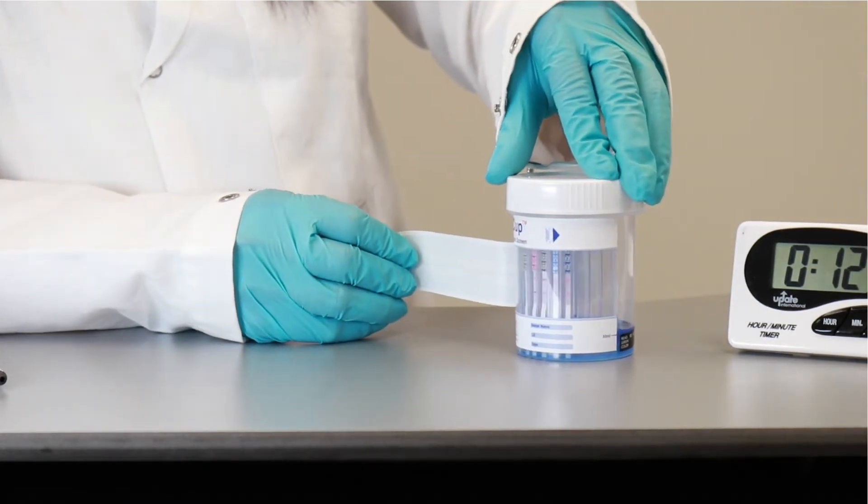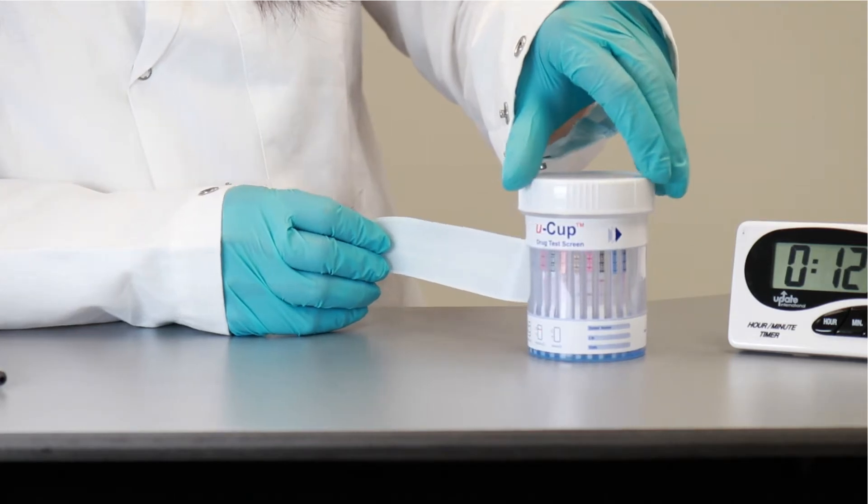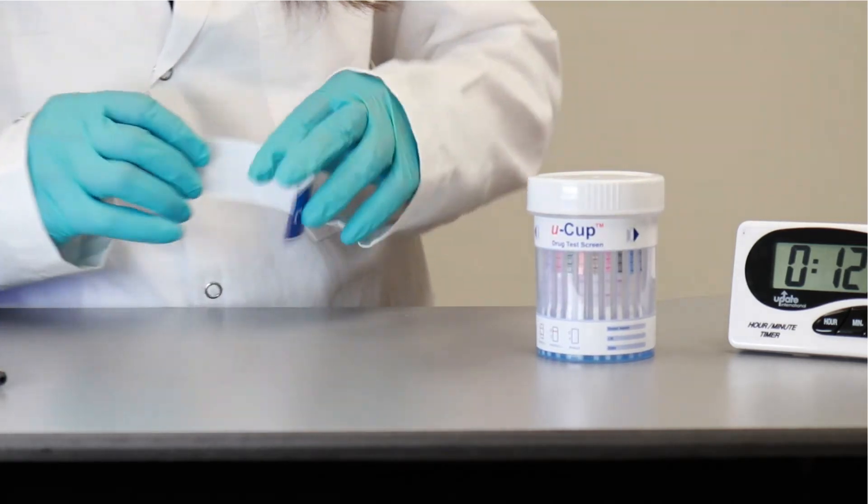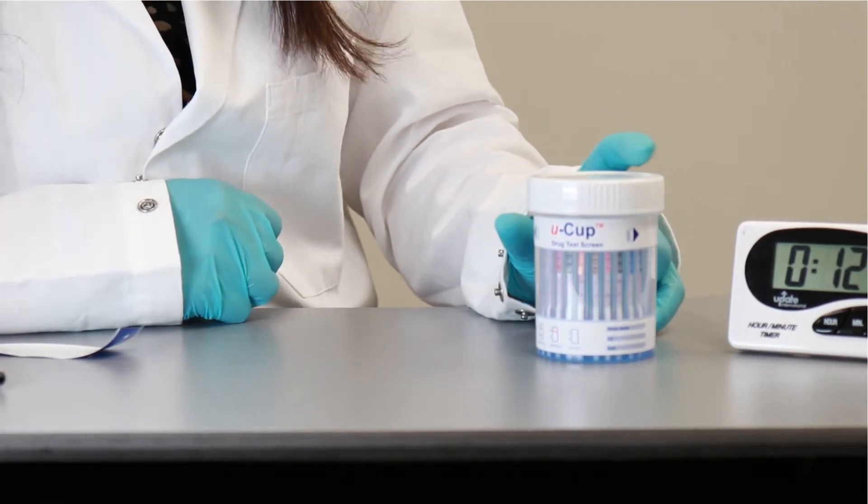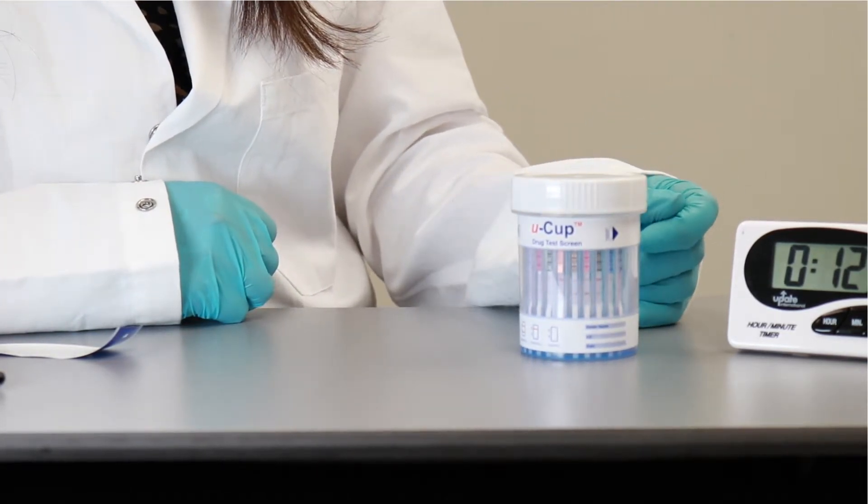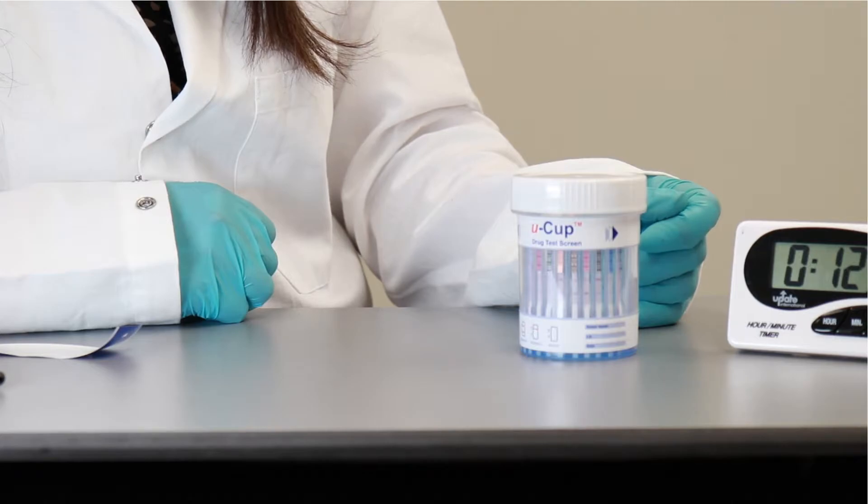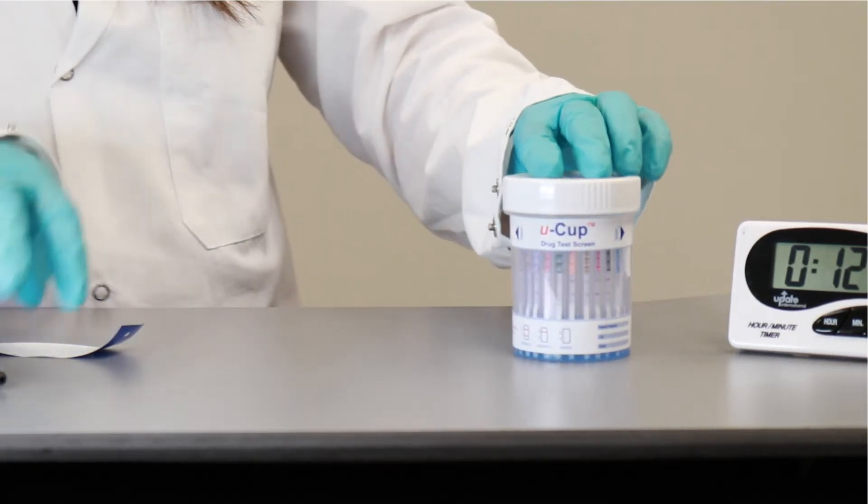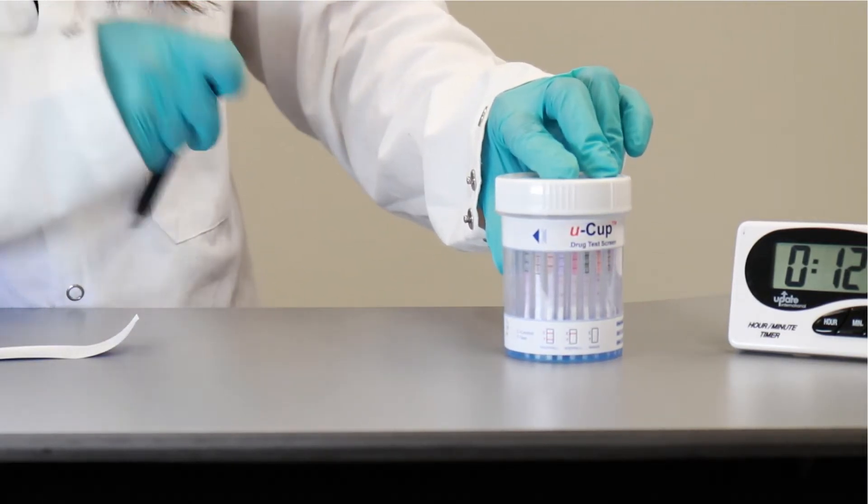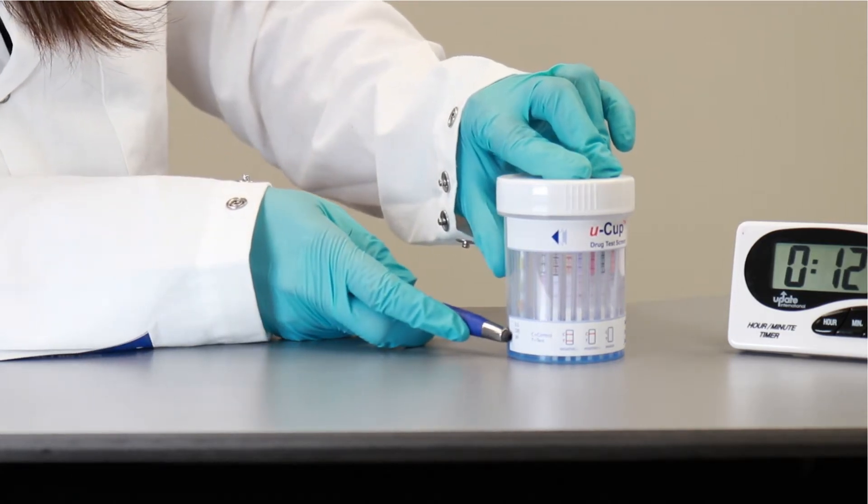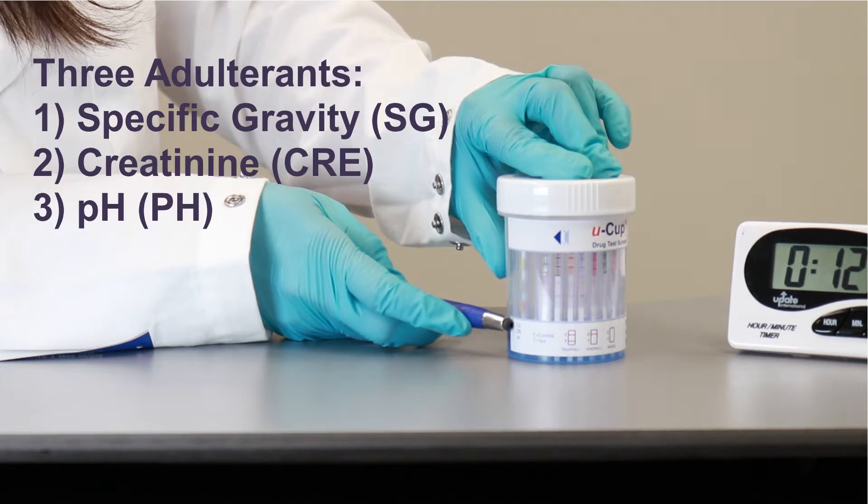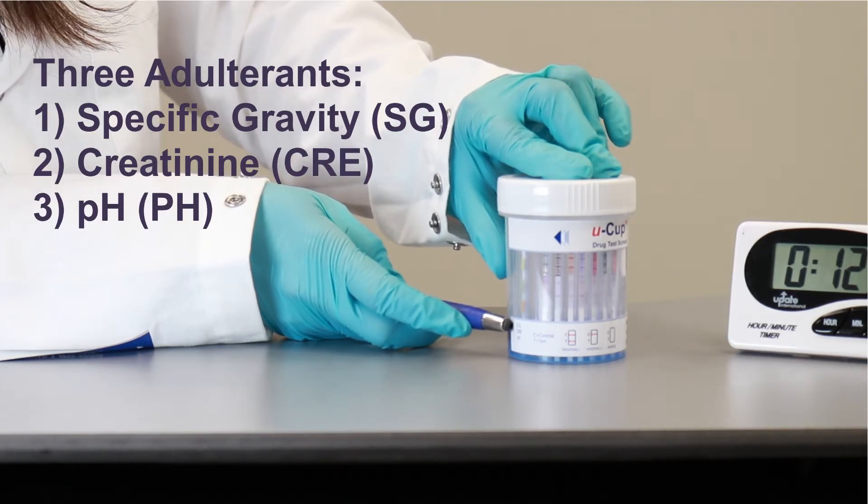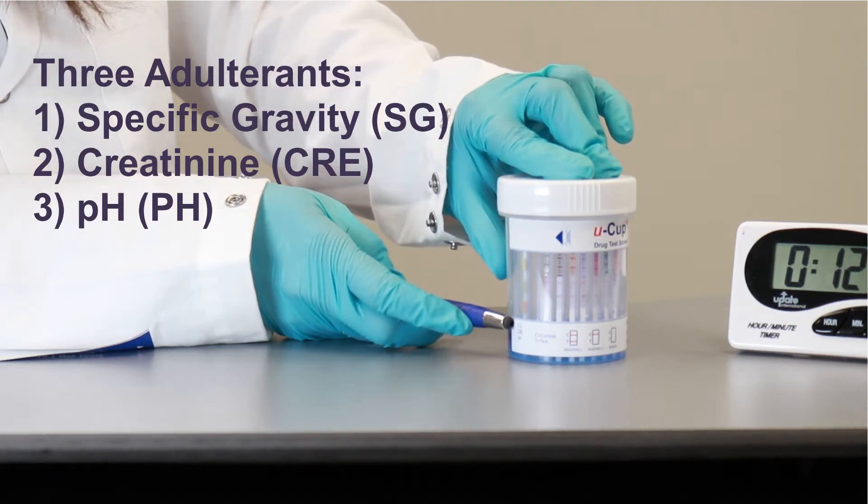So it's a very rapid test that goes really fast in case of negative drug panels. If it is positive, then you are supposed to wait up to 4 minutes to call the result positive. Right here, you have three adulterants on this particular cup. That's specific gravity to make sure that the urine has normal range of specific gravity.